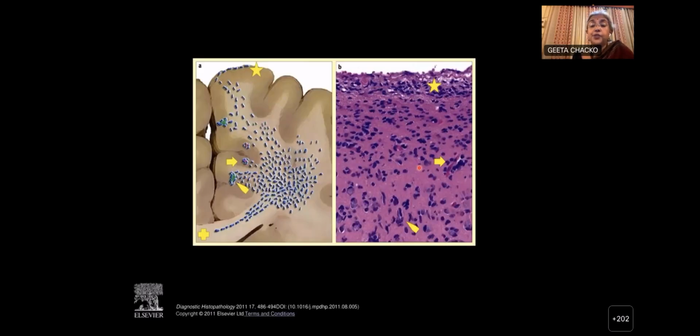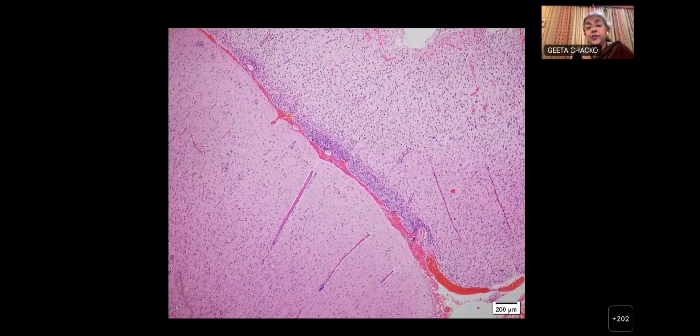And this I've shown before in a previous talk. The diffuse, like I said, is that the tumor cells diffusely go into the brain parenchyma. So here you're seeing what is called subpial satellitosis. This is the pia, subpial satellitosis. Anvesha talked about this perineuronal satellitosis. Yes, I think in the last class, Vani had shown perivascular satellitosis, and that's the tumor cells sticking to or congregating in certain areas when they diffusely infiltrate.